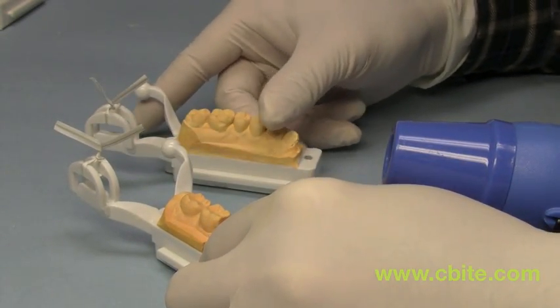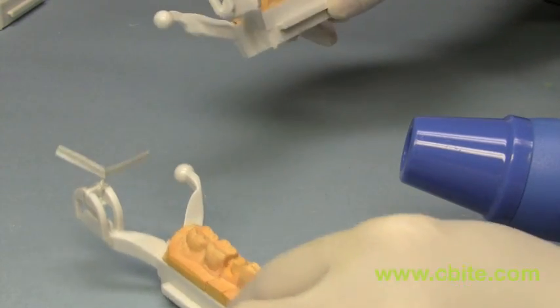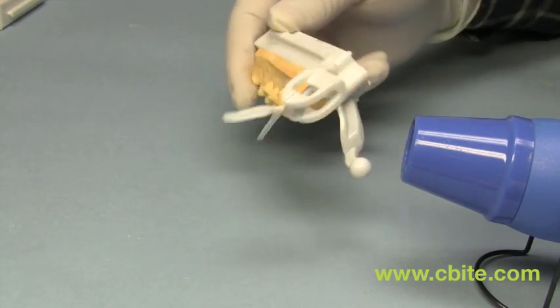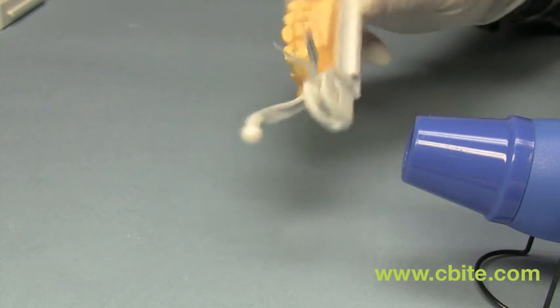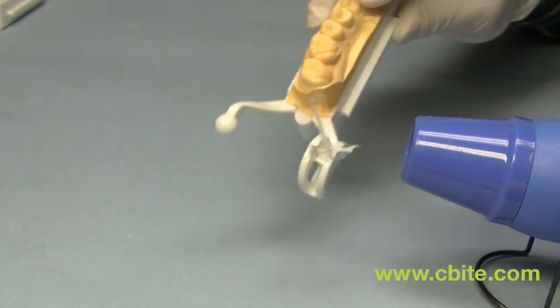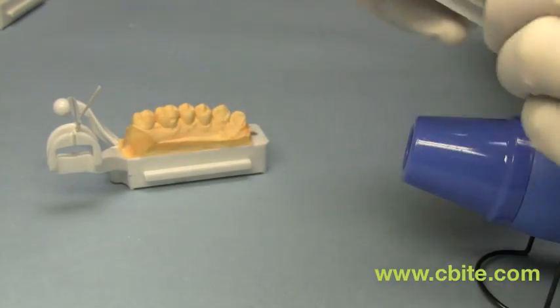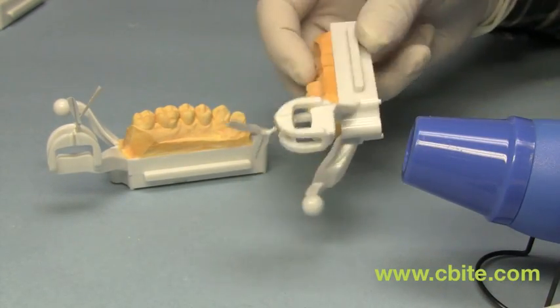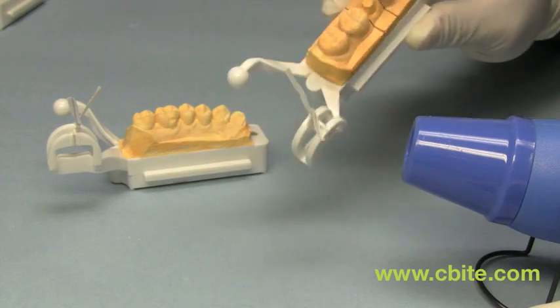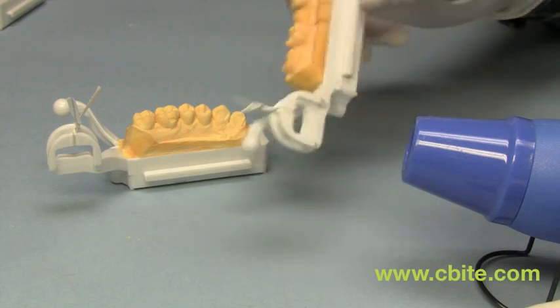Once you have both done, turn on the heater gun and gently heat around the area. Make sure you do not overheat it because you do not want to melt the plastic. Once it's been heated sufficiently, put it aside and do the same for the other. Just gently move it around. Be careful not to overheat.